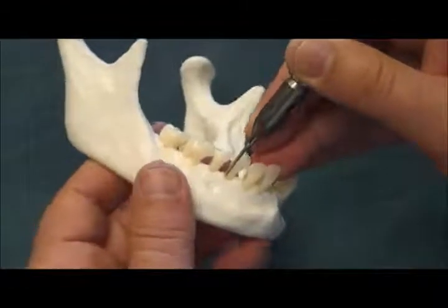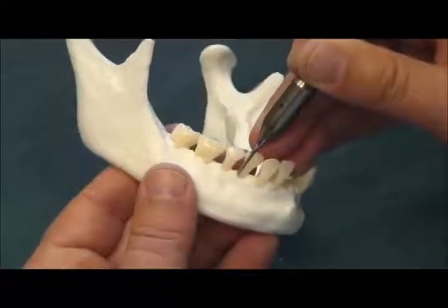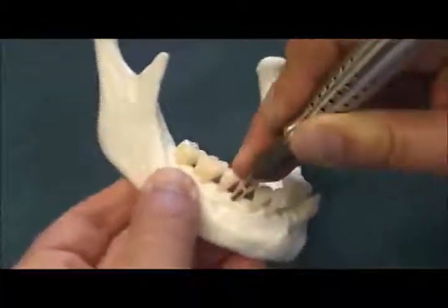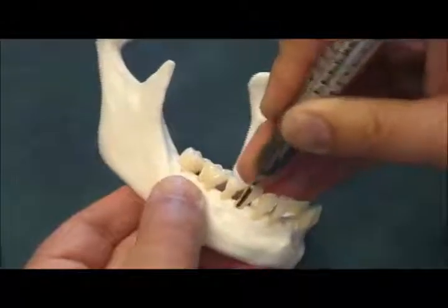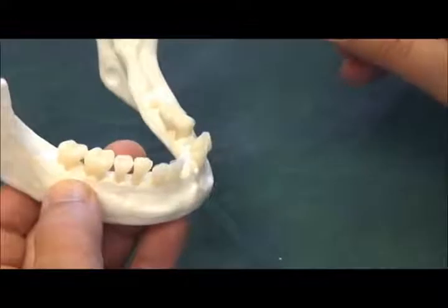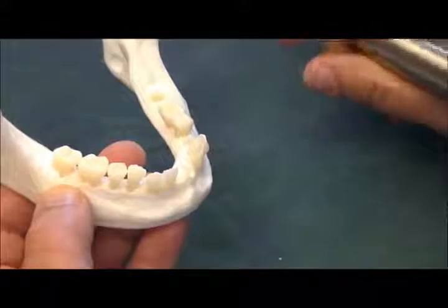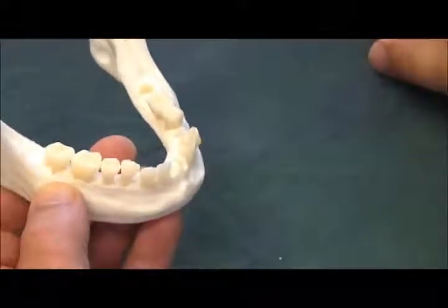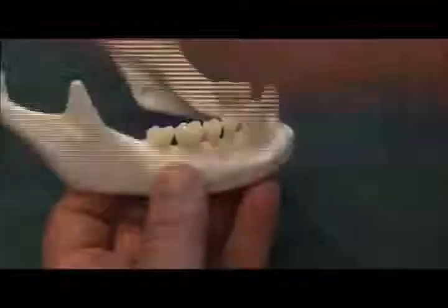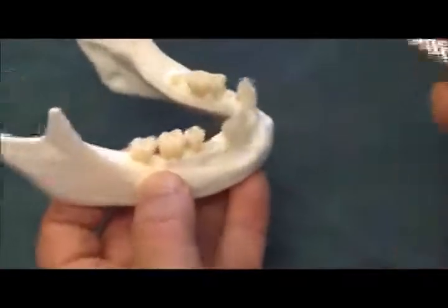To get the facial freed up, you go to, in this case, the distal buccal line angle. Go there, and then just start bigger sweeping motions up to the facial, and you basically will move the tip of the instrument up to the facial area. And that bone, as you know, can be very, very thin, even paper thin, and you should be able to get the tooth out without perforating that buccal bone, which is critical for bone-sparing extractions. Now at this stage, I would go ahead and actually remove the tooth with forceps, and basically it lifts out.